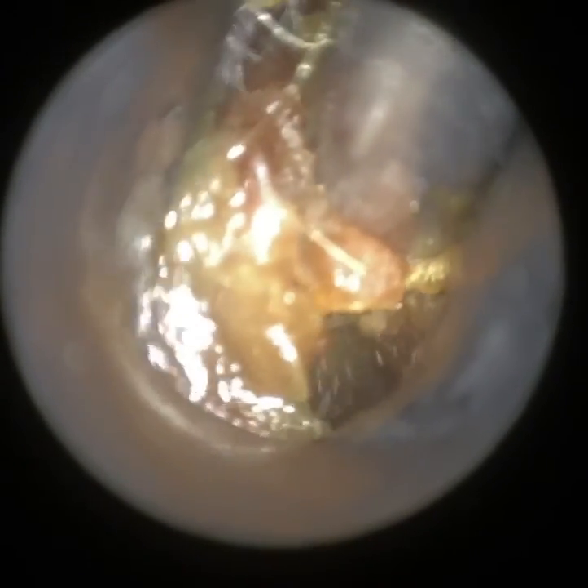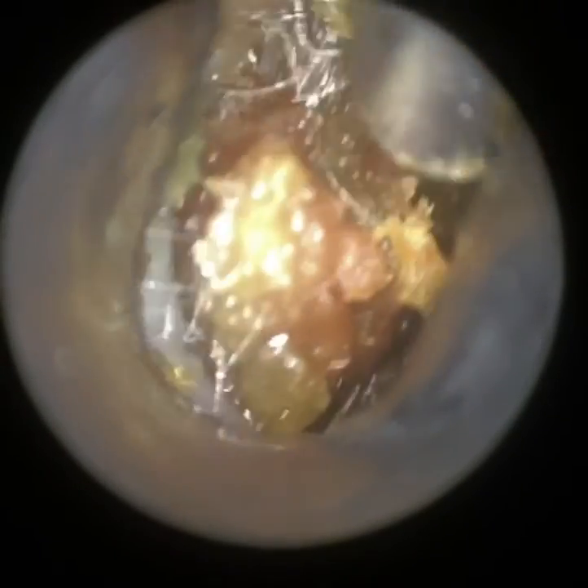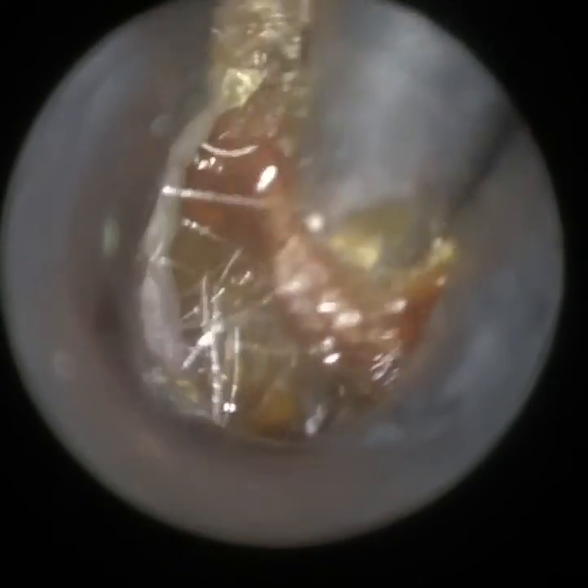Slowly but surely, I'm now going to wriggle this out of the ear. Before I do that, I'm just trying to loosen it slightly because I can feel there are some skin adhesions holding the plug in place. Now I'm slowly coming away with the suction probe — if you come away too quickly with a sucker, you lose the suction grip. So once you've got that suction grip, you just come away slowly and make little wriggle movements.